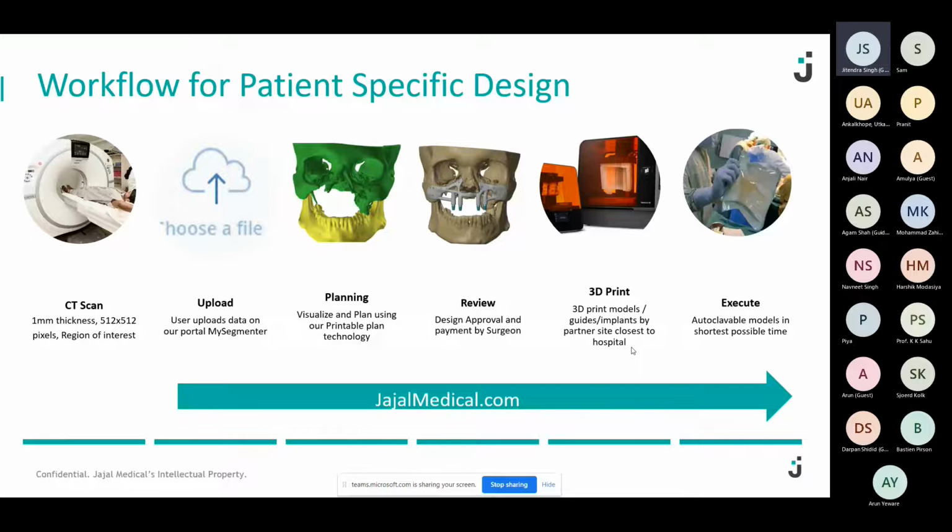Then we can understand how the custom-made device, in this case a custom-made implant on an oral maxillofacial area, would work, and then 3D print that specific implant in the desired technology, and finally execute the surgery using that plan.